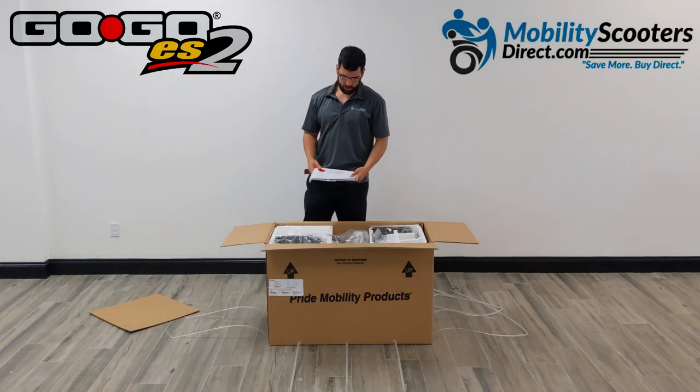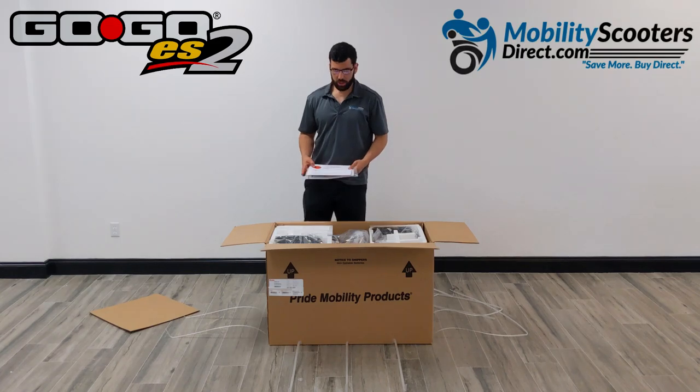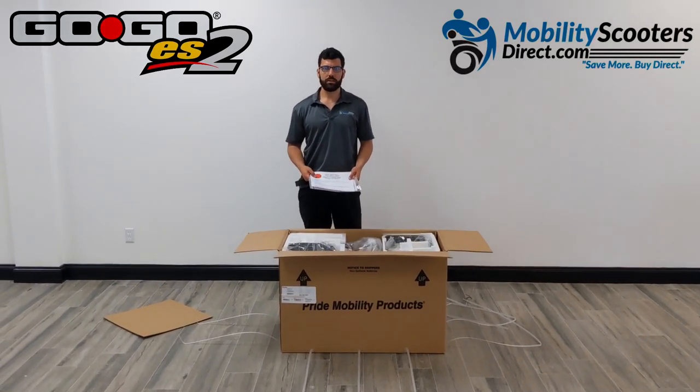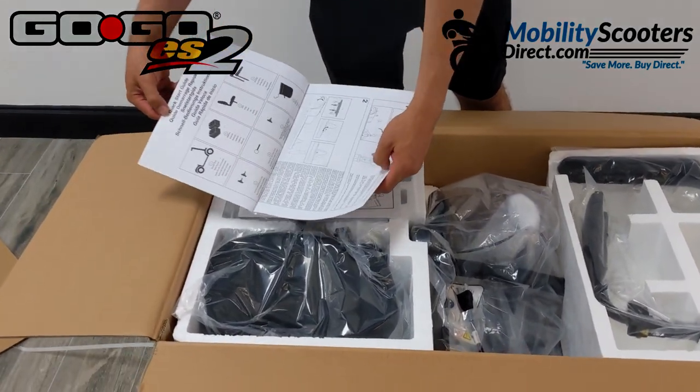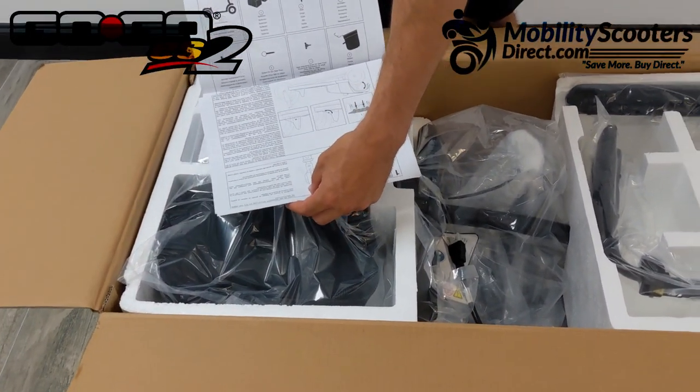We don't need the assembly guide — we're going to show you how to do this with a video. We've done this many times before. It's a very straightforward process and should only take about 10 or 15 minutes at the most. If you want to refer to the quick assembly guide, you can do so.